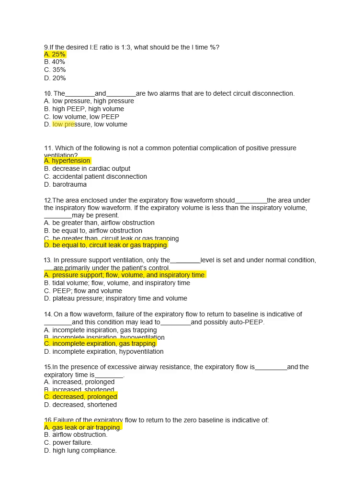And as a result, the time taken for the entire breath to be delivered or the expiration to happen will be prolonged. So there will be resistance, so it will take a longer time for the expiration to be completed. So as a result, the expiratory flow will be reduced and the expiratory time will be prolonged.